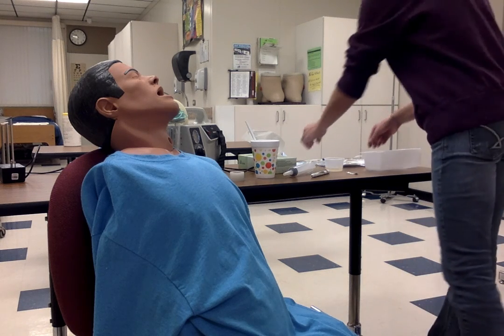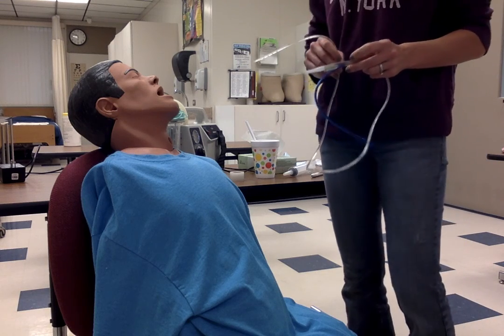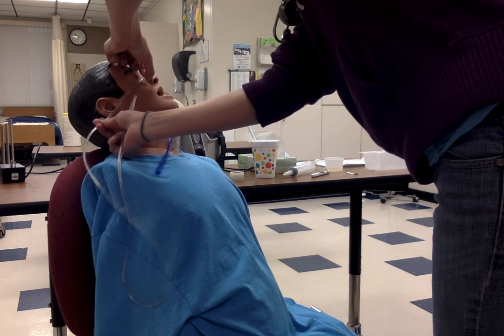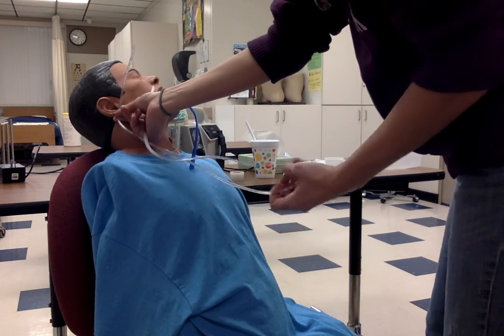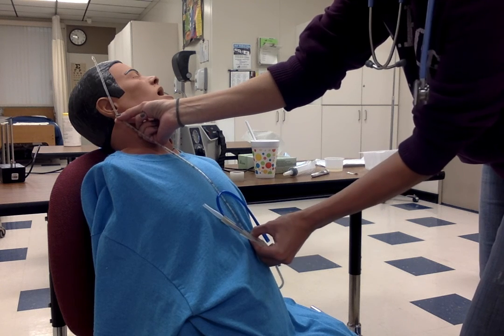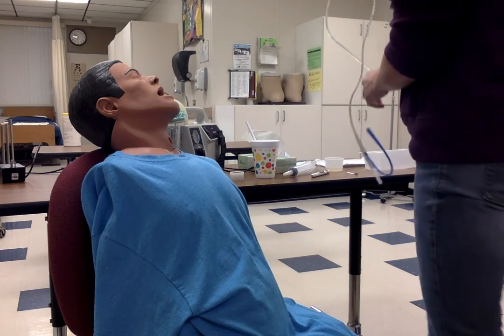So I have my tube, and I don't have a tape measure, so for demonstration purposes, I'm going to go ahead and measure with my tube. So you want to use the nose to ear to xiphoid. So we're going to go from the nose to the ear, and we measure in centimeters. Then from the ear, you want to go down to the xiphoid. And about here. So I would say that now 51, 2, 3. So we're at the 53 mark. Average is about 55, so that's good.